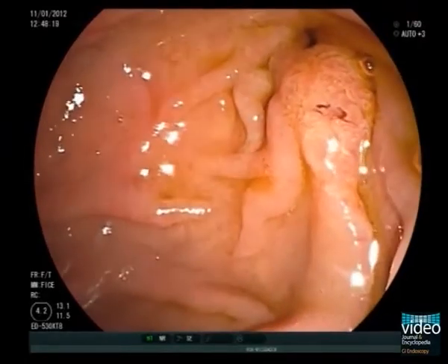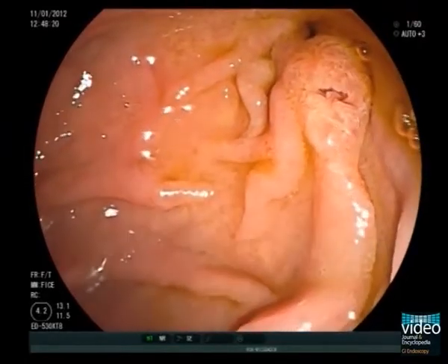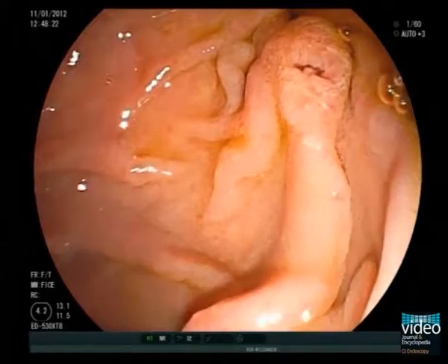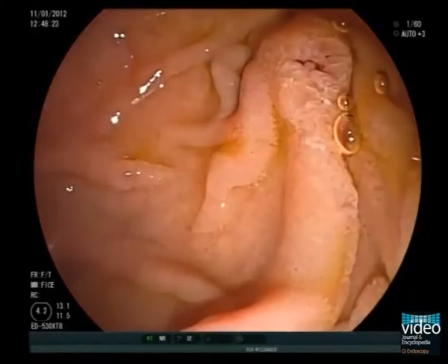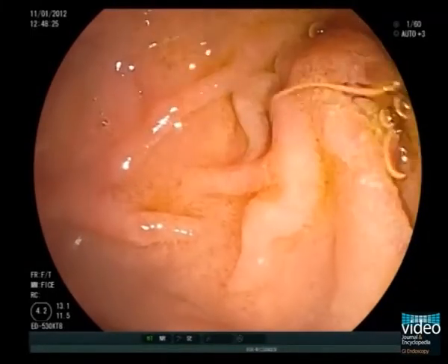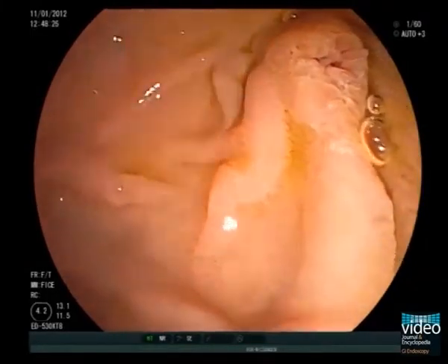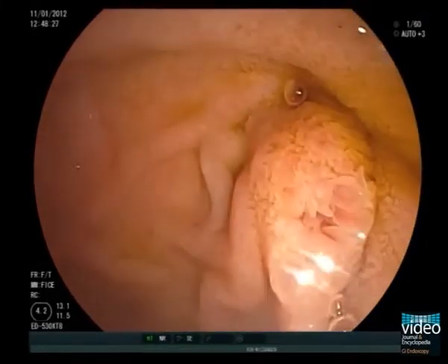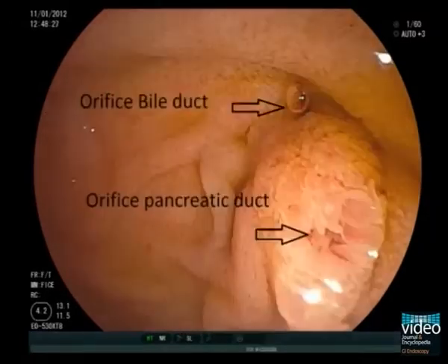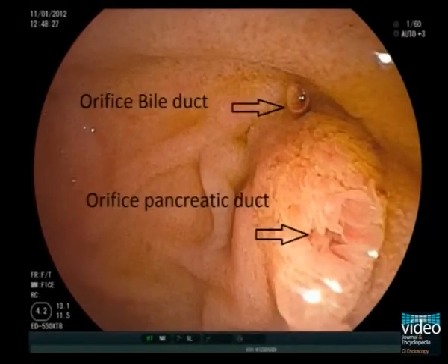First of all, let's have a close look at the papilla. After accomplishing an optimal position of the duodenoscope, we see that the papilla shows separate orifices of the bile duct and the pancreatic duct. This is an important information before we attempt cannulation.